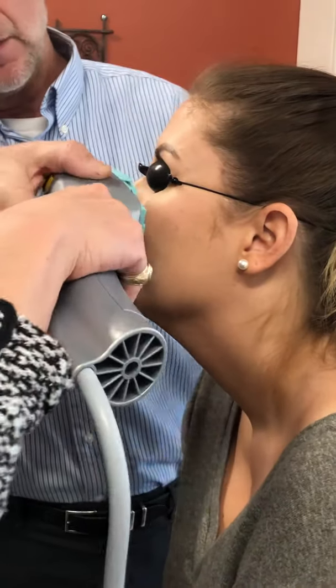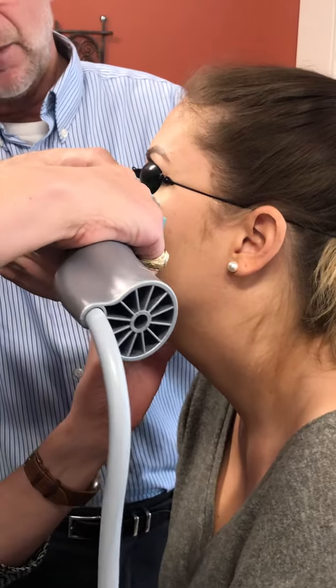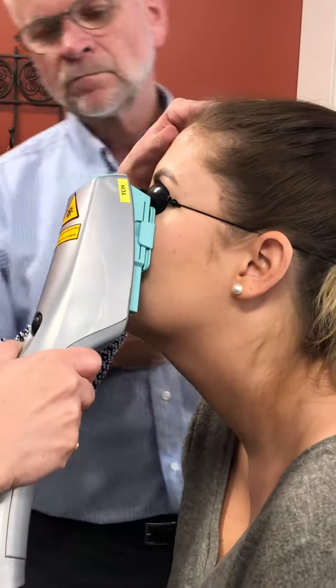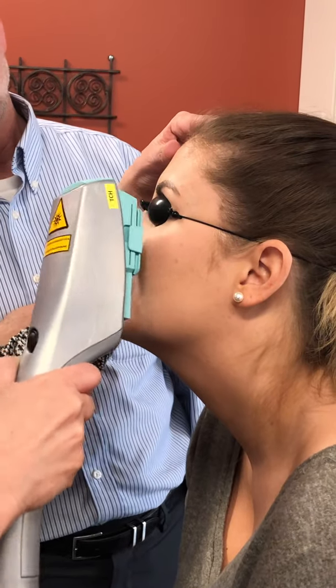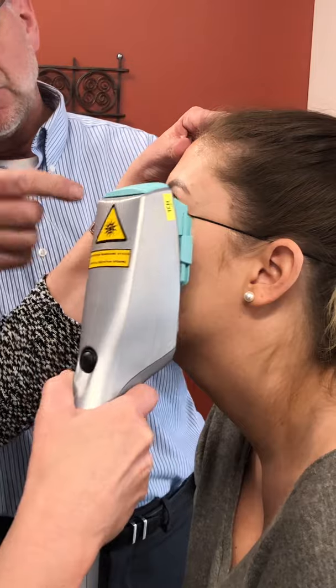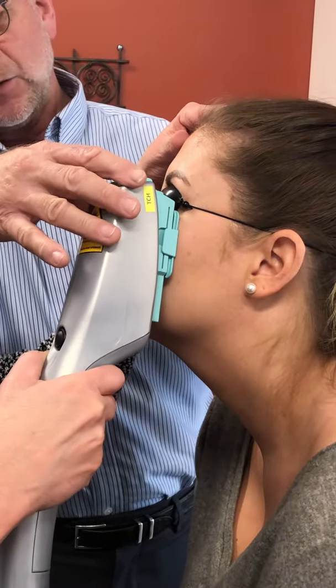Get the back of your wand up a little bit. Maybe she's a little high, but right in there, okay? See how you're just coming across to blend it all. Right, so I'm just trying to figure out my points. We got 1, 1. 2, yeah, 2. Maybe just overlap them a little bit. There would be 2, okay?